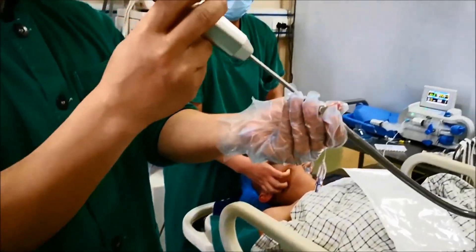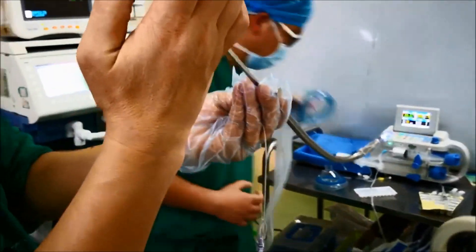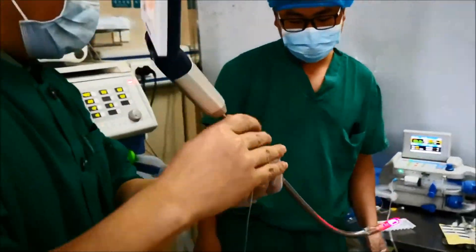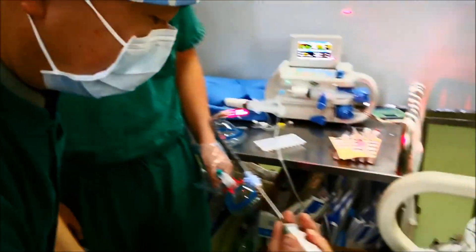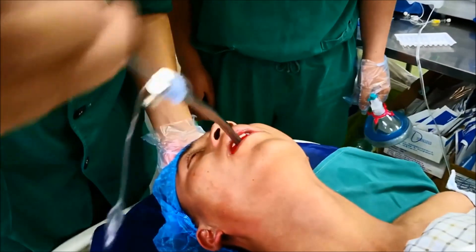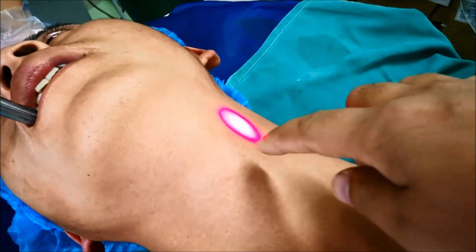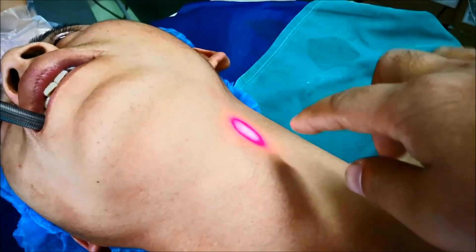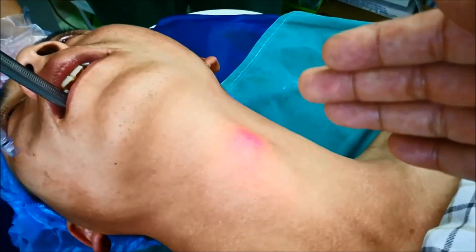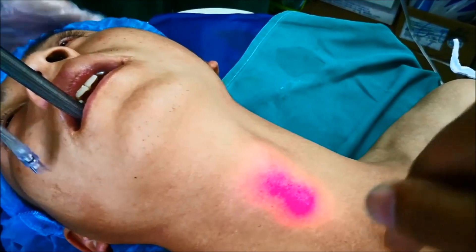This is the newest red light styled video lens scope, invented by Professor Zheng Xiu-Fa. He starts the red light, then puts it into the patient's mouth. You find the initial red light on the left side and check left, right, and the airway using the red light.